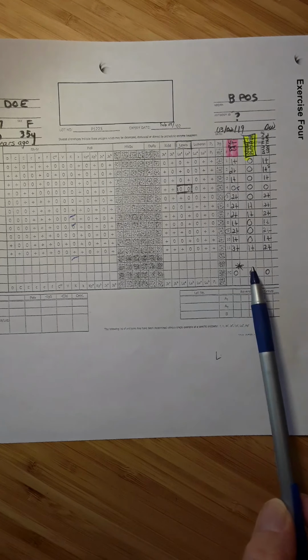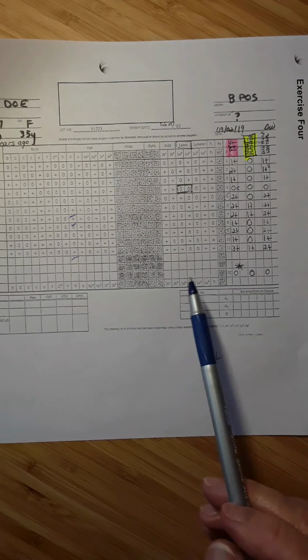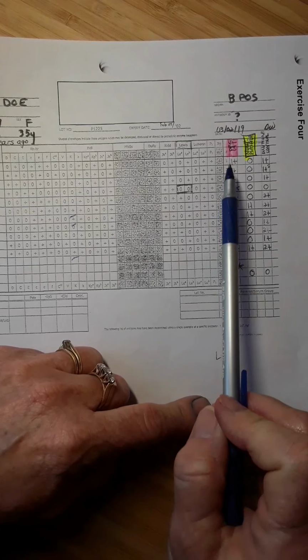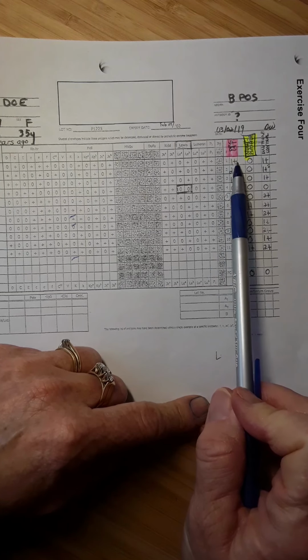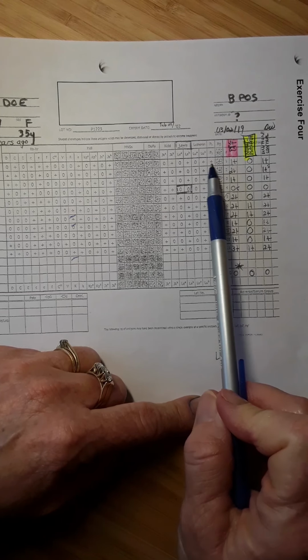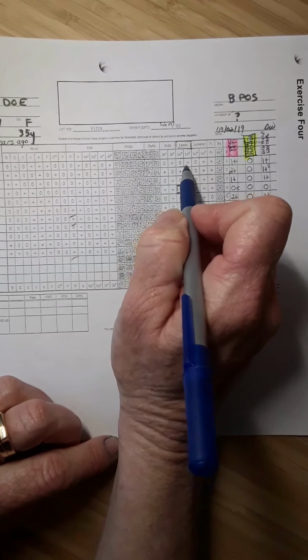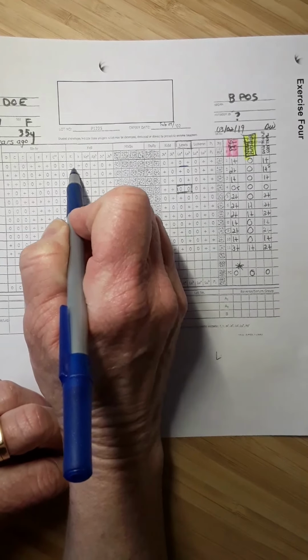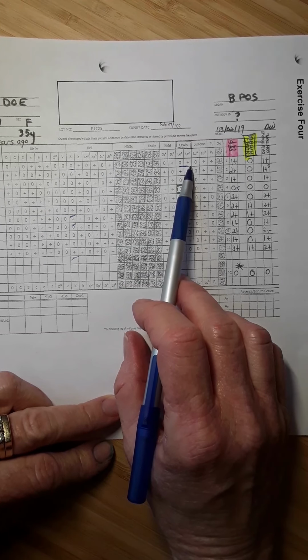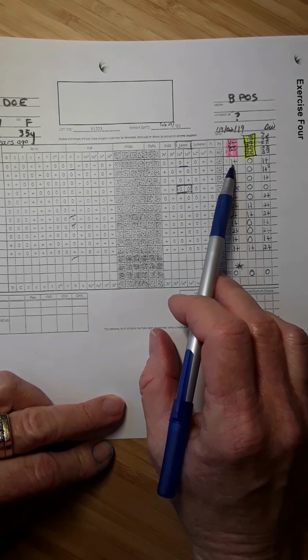Now, once I've made these decisions that the patient has an anti-Lewis A, anti-Lewis B, and an anti-K, I'm going to look back at these original reactions and see if that makes sense. So the patient's plasma was put in a tube and I got a 1+ reaction with panel cell 1. That cell has Lewis B on it. It doesn't have Lewis A on it, and it doesn't have the K antigen on it. So I'm thinking that the patient's plasma is reacting with Lewis B and giving us a 1+ reaction.